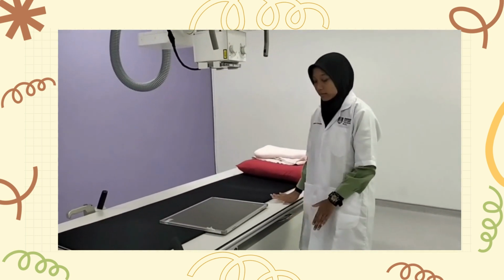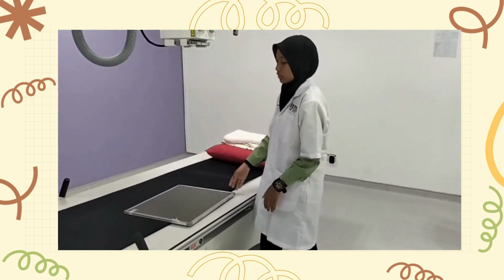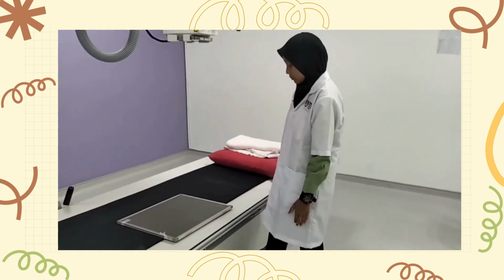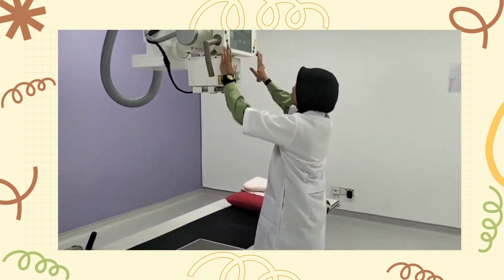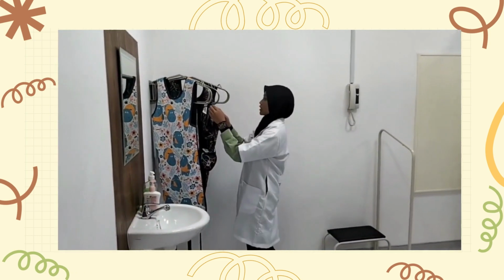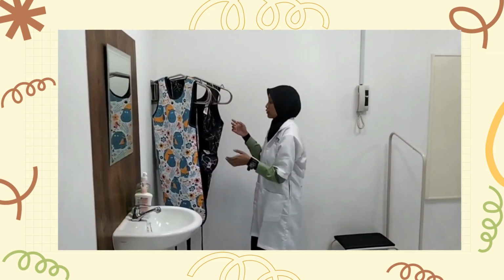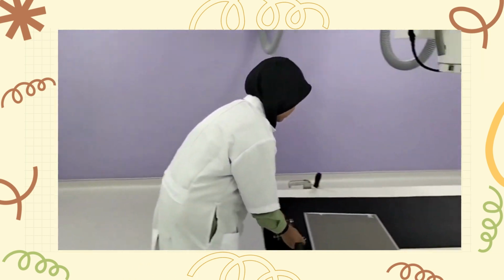Lower the table bucky for the patient to sit at the table bucky. And then we're gonna prepare the protection. So for my protection for this X-ray examination, we're gonna use only the thyroid shield to protect our thyroid. So we prepare it here. It's done, and then you can call the patient.